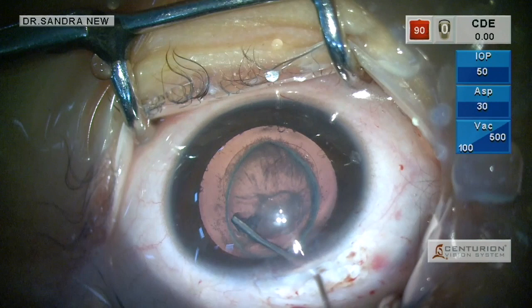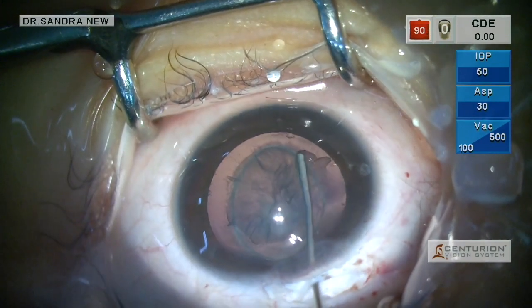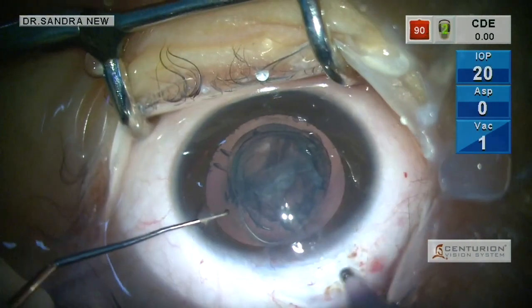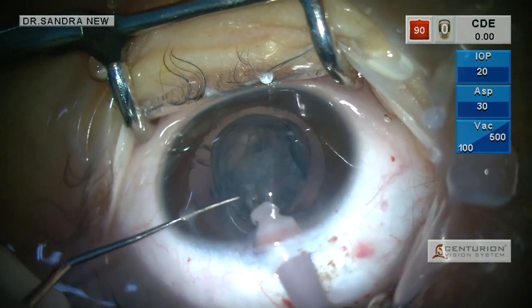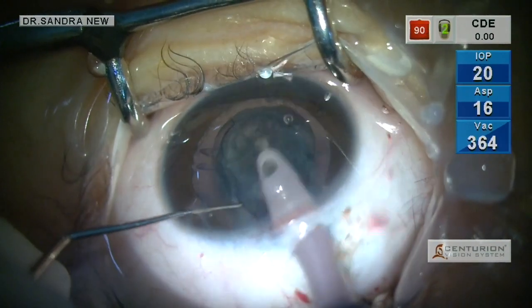I am doing a small hydrodelineation in order to loosen the cortex, which will enable easy aspiration. I do not want to spend too much time hydrating the cortical matter due to the presence of the pre-existing posterior capsular deficit.